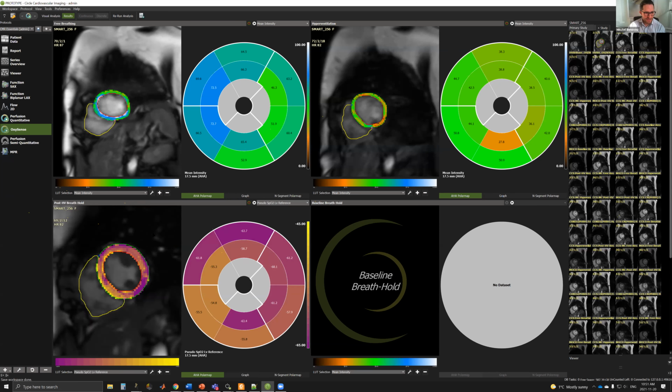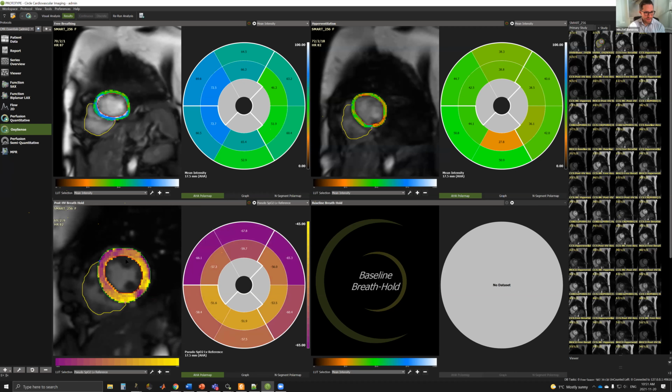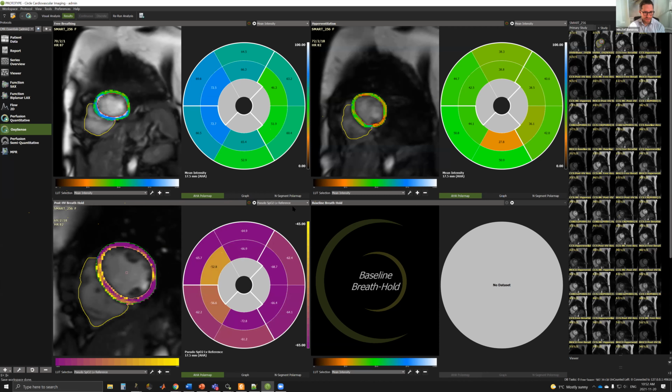Yeah, that's pretty much it. This is the way we can analyze the results. You can add the biomarkers to the scientific reports and easily bring those into Excel or SPSS or whatever you want to use for your statistical analysis. If you see that the contours are not quite right, you can just click on one and edit them manually. For example, if you want to push the contours out from the blood pool manually, you can do that, although that is coming up automatically soon. But you really have full control of the contouring, of the biomarkers you want to report on, and the way you want to visualize them.